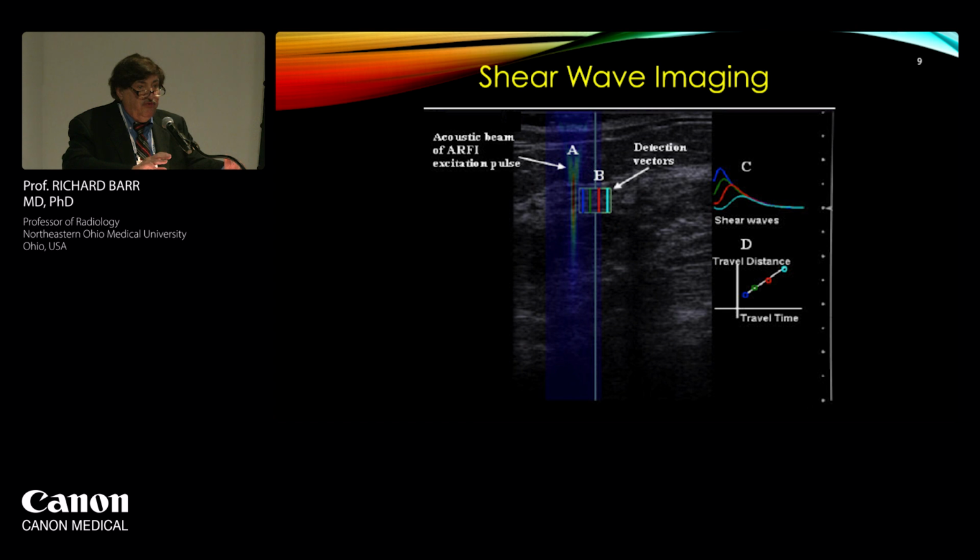I just briefly want to review shear wave elastography. The SRU guidelines, I think, have become the standard for the world, really, in evaluating how to do an appropriate shear wave elastography. And if you look at the two papers, one published in 2015 and one published in 2020, they go over a lot.